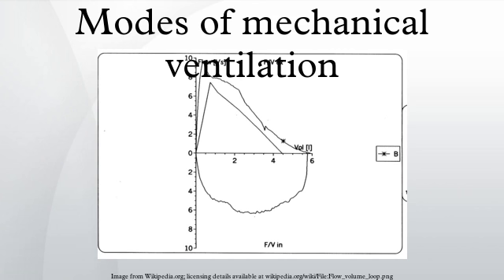While APRV is common to users in North America, a very similar mode, biphasic positive airway pressure, was introduced in Europe. The term APRV has also been used in American journals where, from the ventilation characteristics, BIPAP would have been perfectly good terminology. But BiPAP, TM, is a trademark for a non-invasive ventilation mode in a specific ventilator. Other manufacturers have followed with their own brand names. Although similar in modality, these terms describe how a mode is intended to inflate the lung, rather than defining the characteristics of synchronization or the way spontaneous breathing efforts are supported.